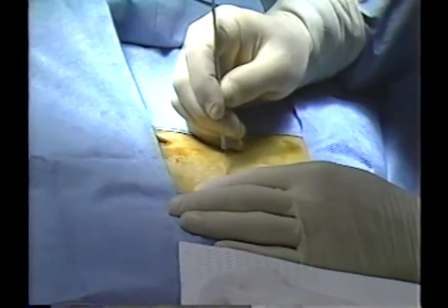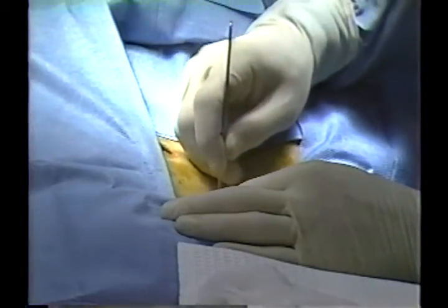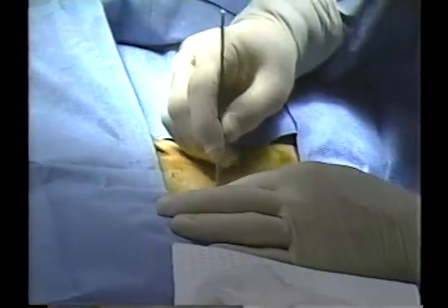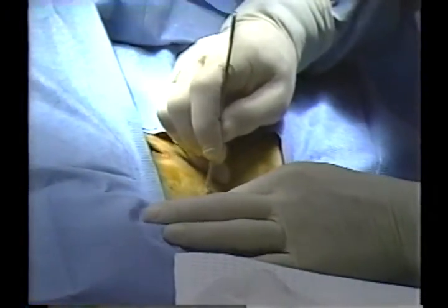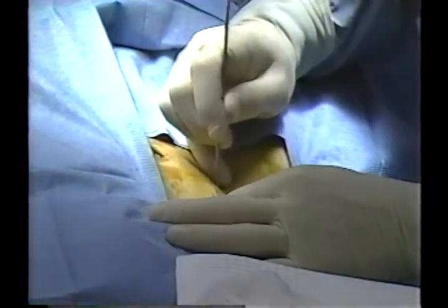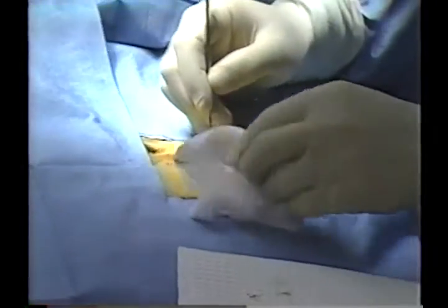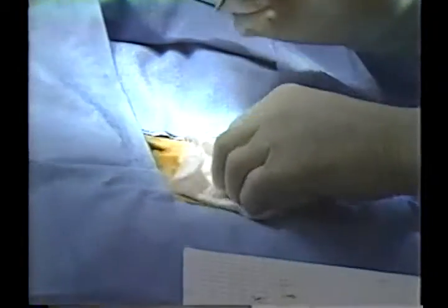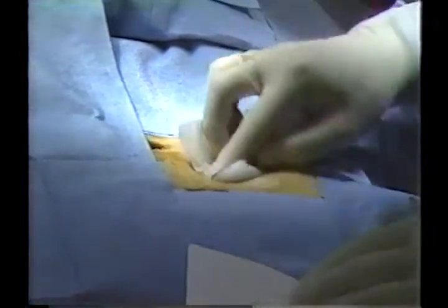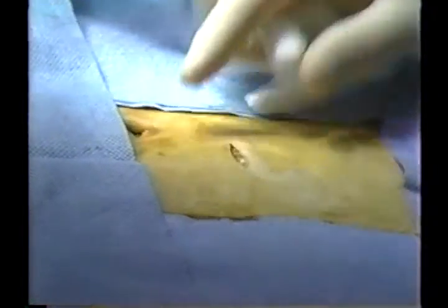A 2 centimeter vertical incision is made through the skin to the level of the abdominal wall, not to penetrate the abdominal wall. The skin incision need be just large enough to allow passage of the distal cup of the catheter.